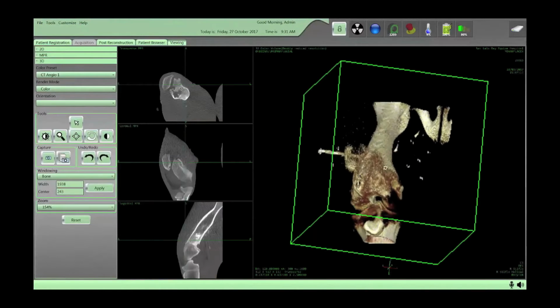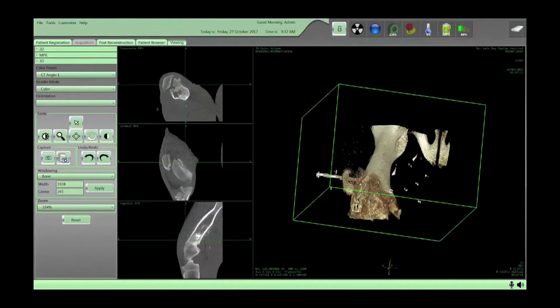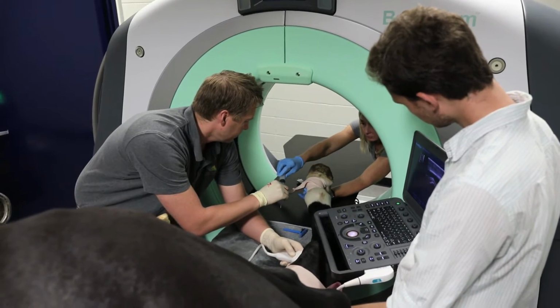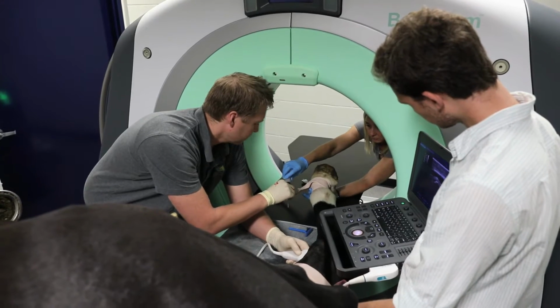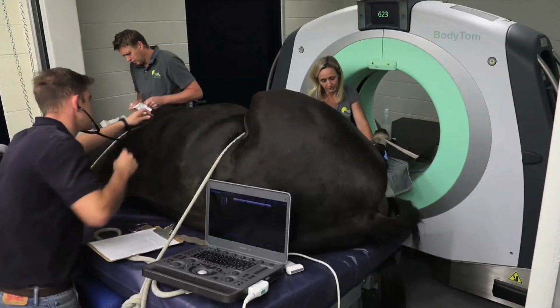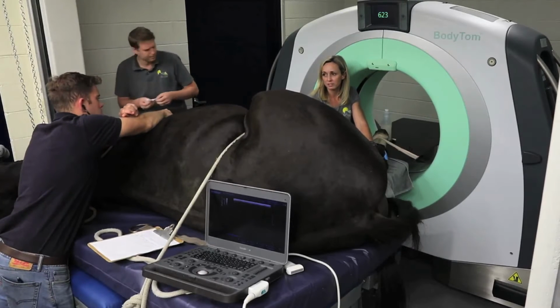This will include feet, anything else on the distal extremity, cannon bones, suspensories. We can get up to the carpus, hocks, and in some patients we can do their stifles. With our distal extremity cases, we like to use arterial contrast to enhance the soft tissue imaging. It really accentuates the lesions for us, especially the acute lesions. But we've been really pleased with the quality of imaging to both the soft tissue structures and the bone surfaces.